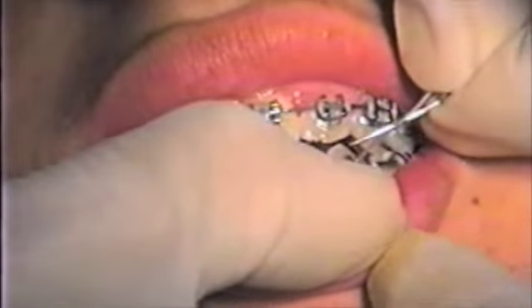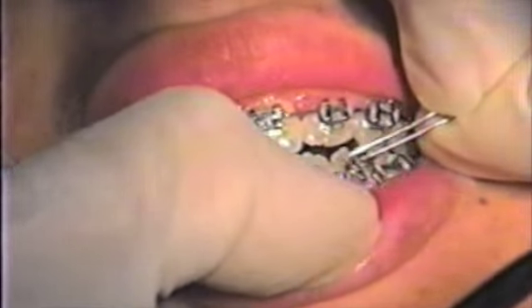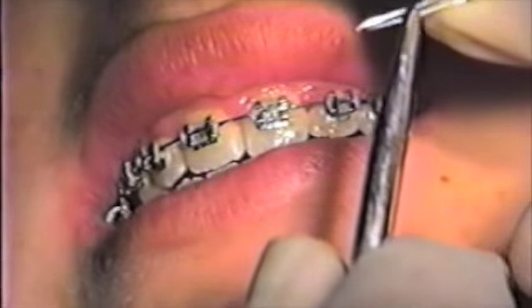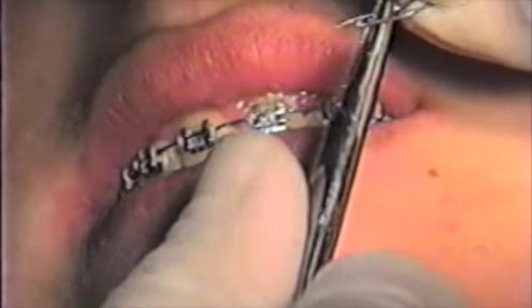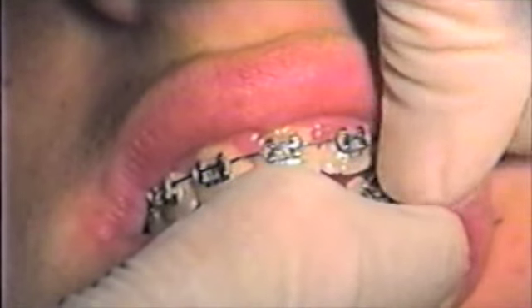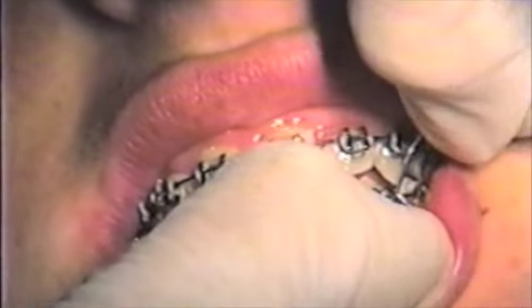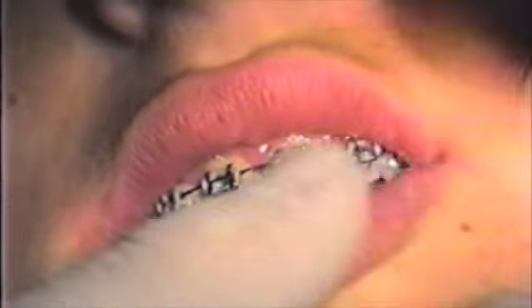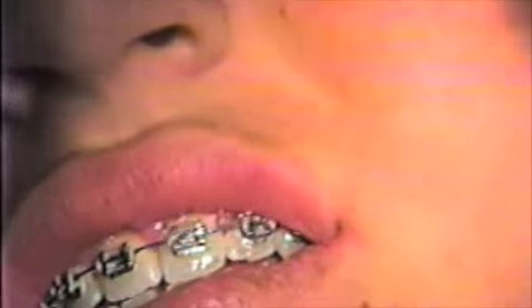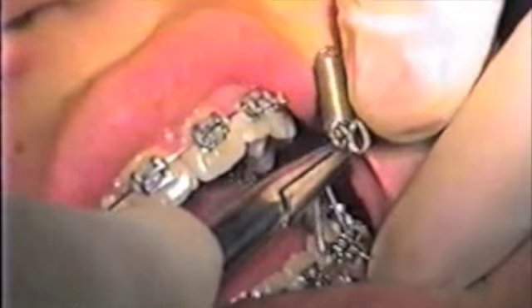Now we'll do the other side, this time starting with the lower cuspid. On some patients, because of gingival hypertrophy, it is difficult to attain the threading underneath the arch wire with a heavy ligature wire.